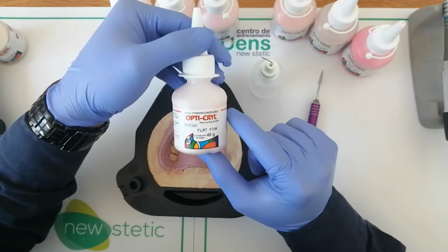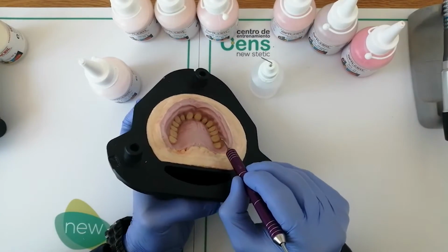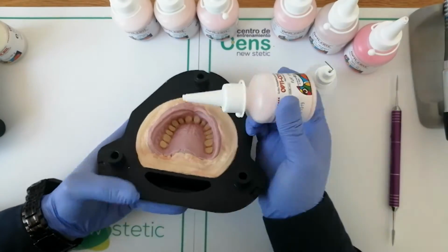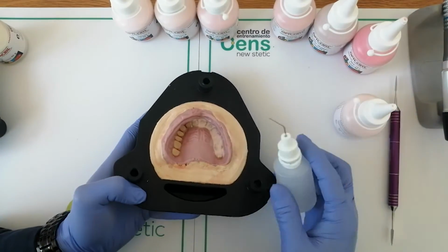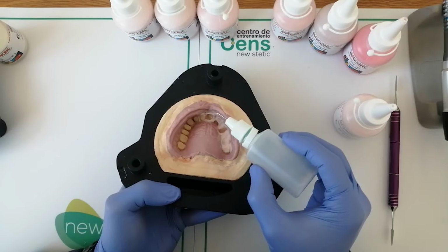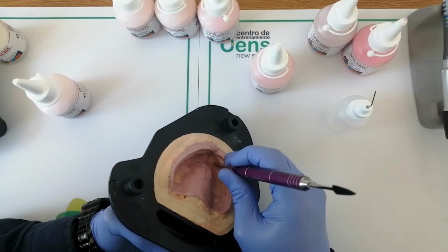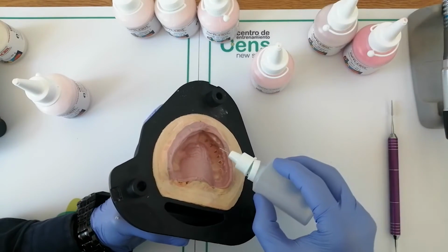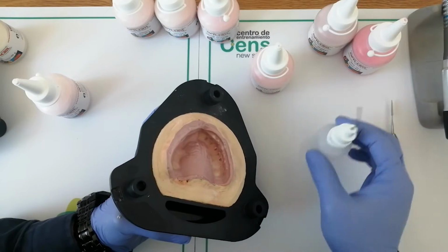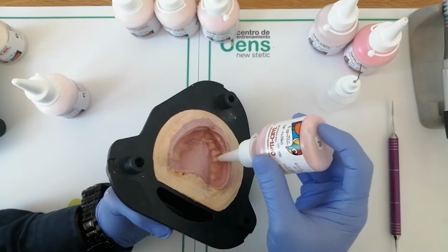In this case, we will use the flat pink color for the free gingiva zone. Place the polymer in small increments in this zone and moisten with Opti-Cryl heat-curing monomer until achieving a polymer with the correct texture. Don't allow the polymer to run. Open some small triangle-shaped gaps on the gingival papilla zone. Place small portions of polymer VR5 color on this zone and then hydrate with Opti-Cryl heat-curing monomer.